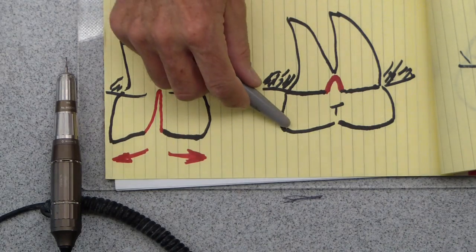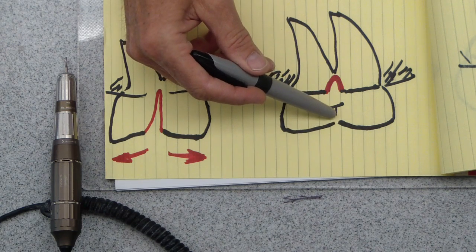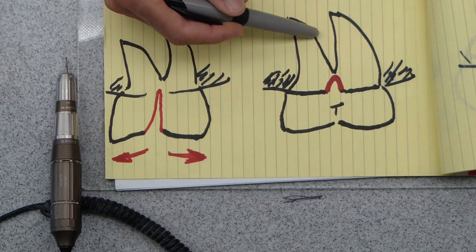The key to extracting teeth either with the forceps or with your elevators is to get down as close as you can to the root of the tooth or to the apex. If you just put force on the top of the tooth here, you're just going to break off the top of the crown. So with either elevators or forceps, one of the keys is getting your instrument down as far toward the apex as you can.